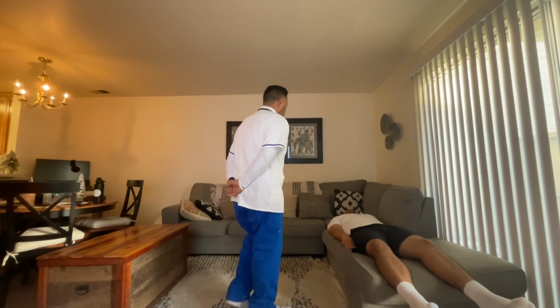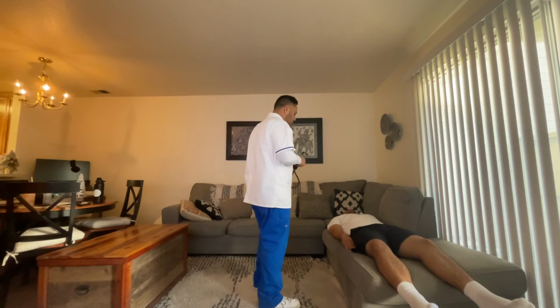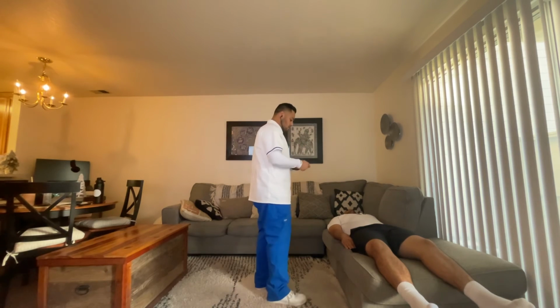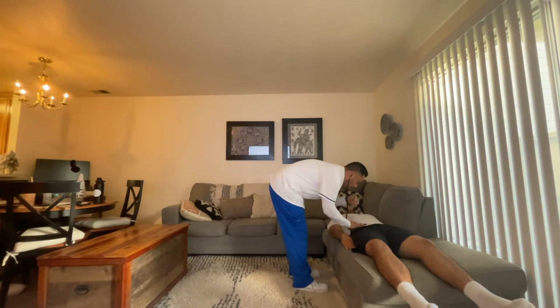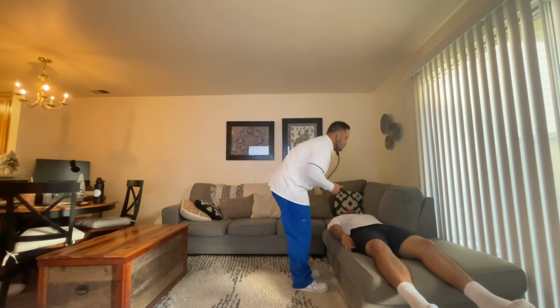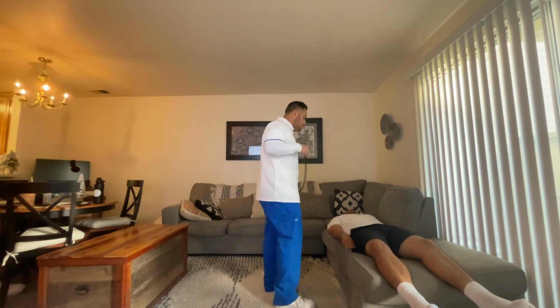I'm going to be auscultating your abdomen. Is that okay with you? Perfect. So I'm going to begin with the right lower quadrant, auscultating for bowel sounds, and I'm going to do it with the diaphragm of my stethoscope. Coming down here, bowel sounds are heard every 5 to 30 seconds. Patient's bowel sounds are normal active, no signs of hyper or hypoactive bowel sounds. There's no borborygmi when not using my stethoscope.